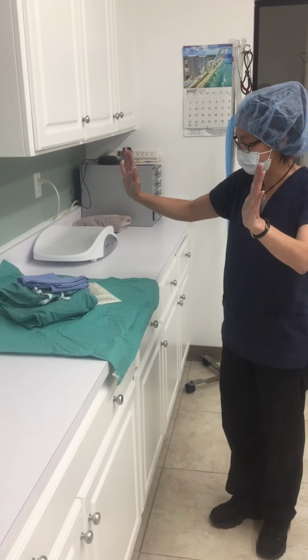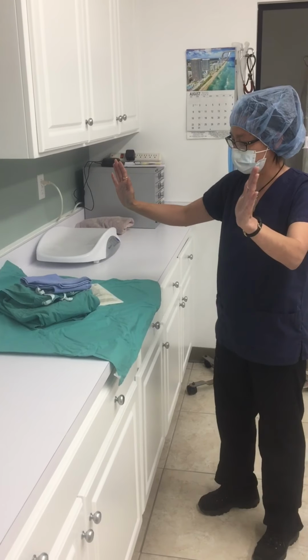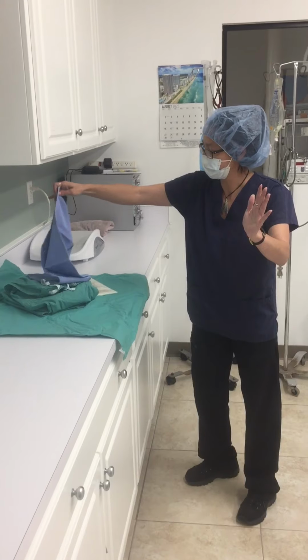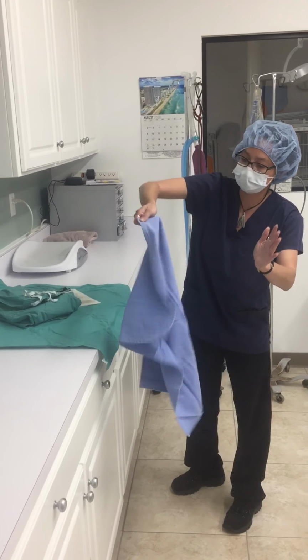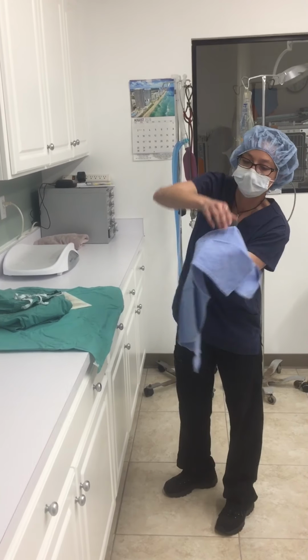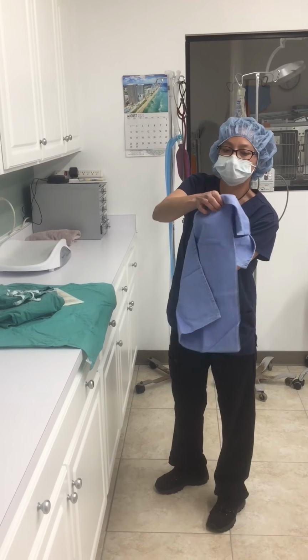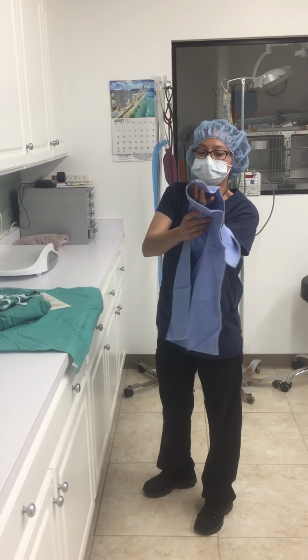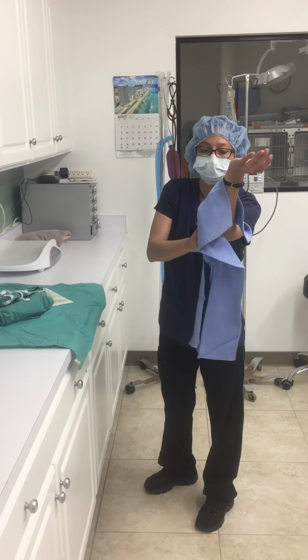We want to come to our pack and stand at a little bit of a distance so that we're not too close. We're going to grab our towel from our fold here and place the front side of the towel on our first hand. We're going to dry each finger, dry the hands, and down your arm.